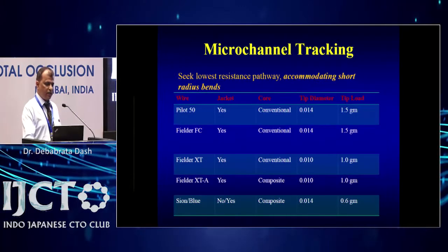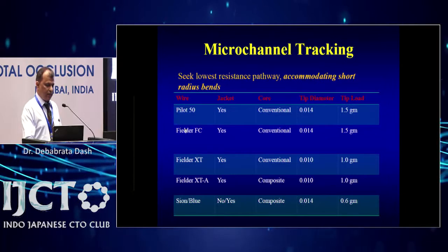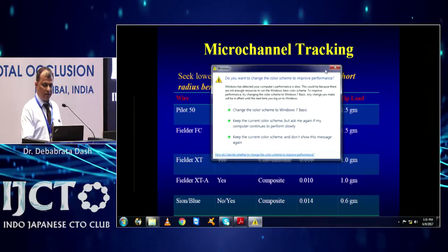Now the directed use of the wire, the microchannel technique, we can have Fielder FC, Fielder XT, XTA. These are the low tip load wires.